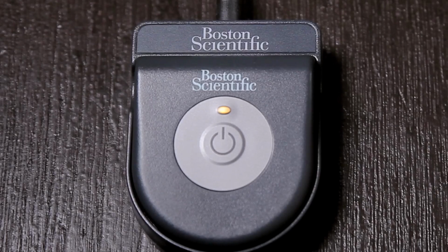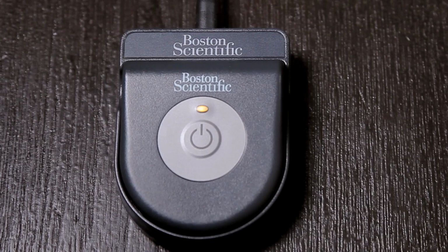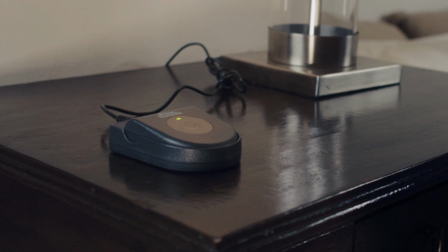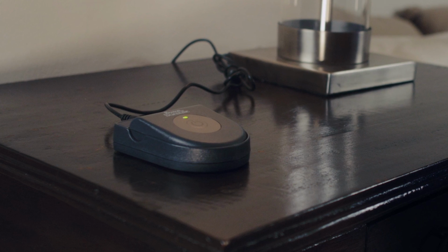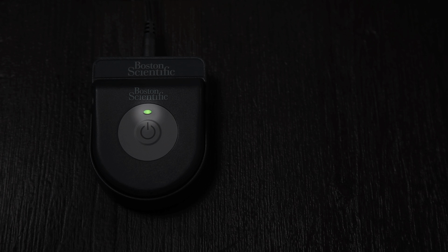Keep the base station plugged in so that it's always ready to deliver a charge. It's designed for this kind of use, so you don't have to keep plugging and unplugging it whenever you need to charge the charging unit. The charger also has an indicator light. When the light is green, the charger is ready to charge your stimulator.